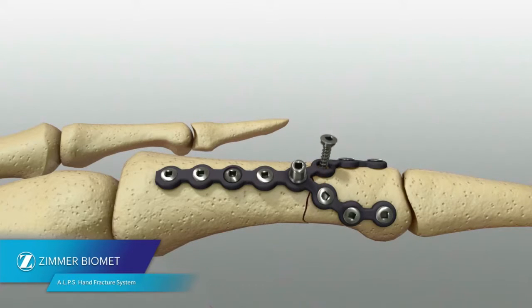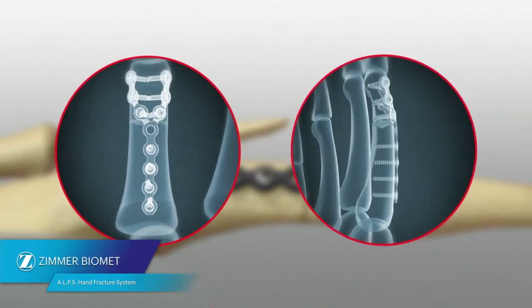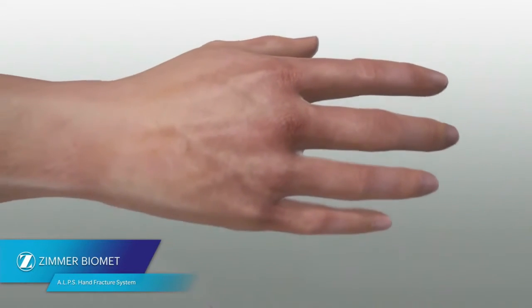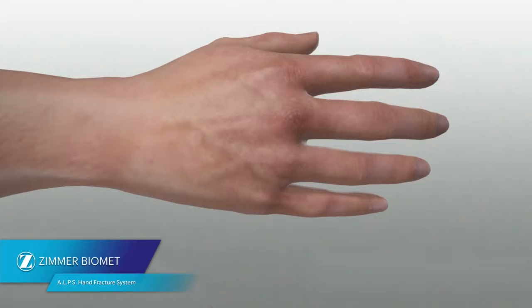Once the screws have been inserted, confirm final plate and fracture fixation using fluoroscopy and close the incision site. Postoperative management will vary by surgeon preference. The ALPS Hand Fracture System Surgical Technique was developed in collaboration with Dr. Matthew Tomeno and Dr. Lloyd Champagne.